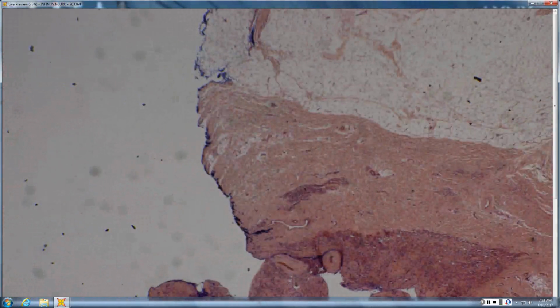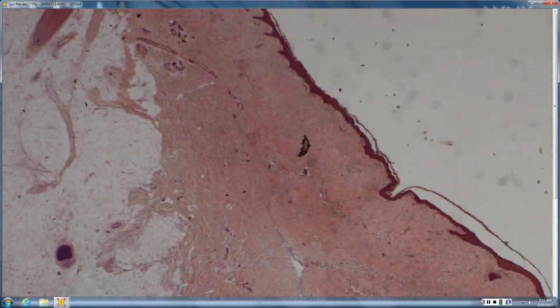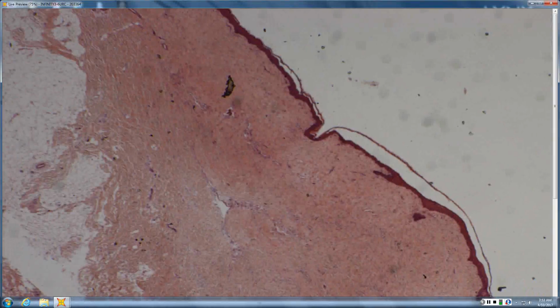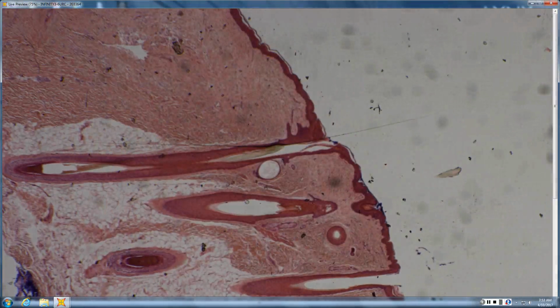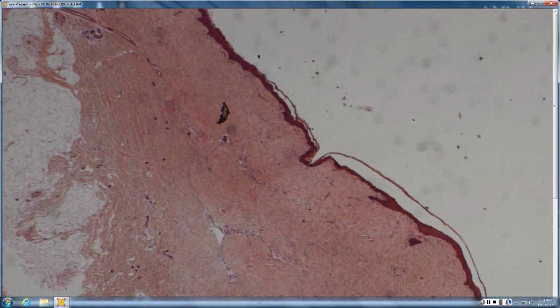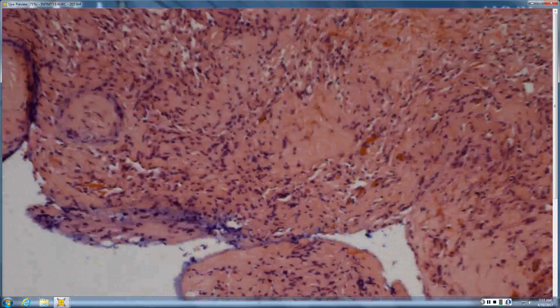So wide excision. There's something in the deep dermis, and the top looks scar-like. Either they've been there before, or since this is scalp, what else would be scar-like? A hairless patch on the scalp from birth. Yeah, like an aplasia cutis congenita. So we've got something that's under a scar or an aplasia cutis congenita.